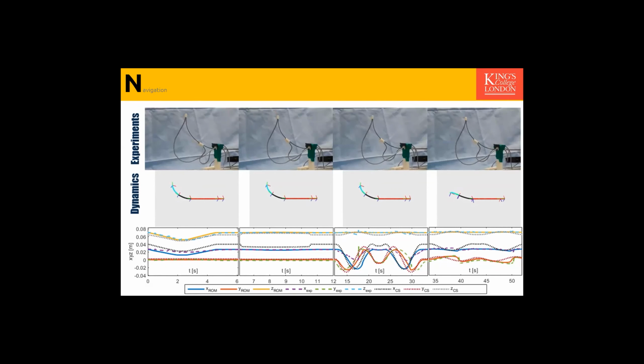So basically, if you rotate the tubes clockwise and it snaps during that motion, and then you start counterclockwise rotation of the same tube undergoing another instance of snapping, the forward and return motion don't coincide, they don't overlap. There's a shift between the plots that you cannot capture with static models. But in this dynamic model, we could successfully capture that, as you see in this part of the plot.